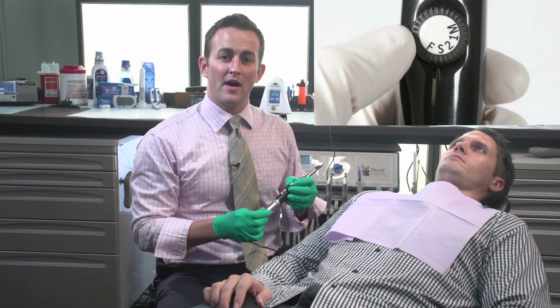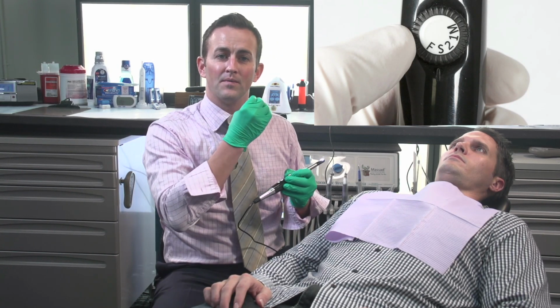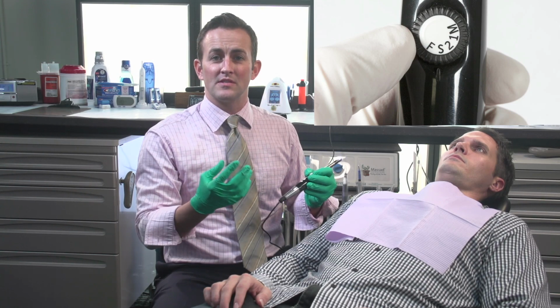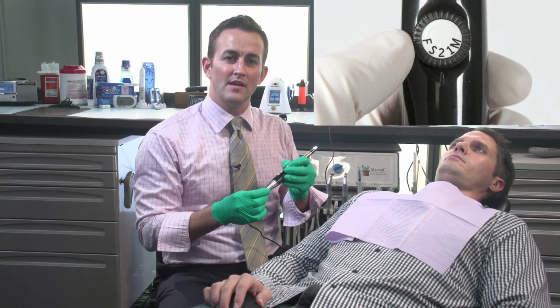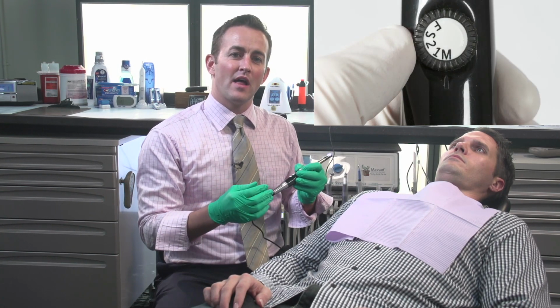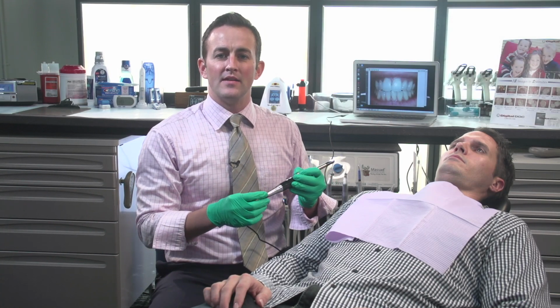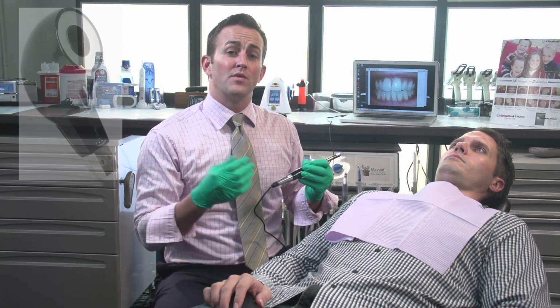The F is for full face, S is for smile. It also gives you an upper and lower arch and a retracted buccal, which gives you 2 additional images on top of the 12 in 2 program. Next is the 2 for 2 teeth, the 1 for 1 tooth, and then the macro, which is for fracture lines and deep occlusion shots. Now let's get started with the 6 extraoral images first, with the glow light attached.